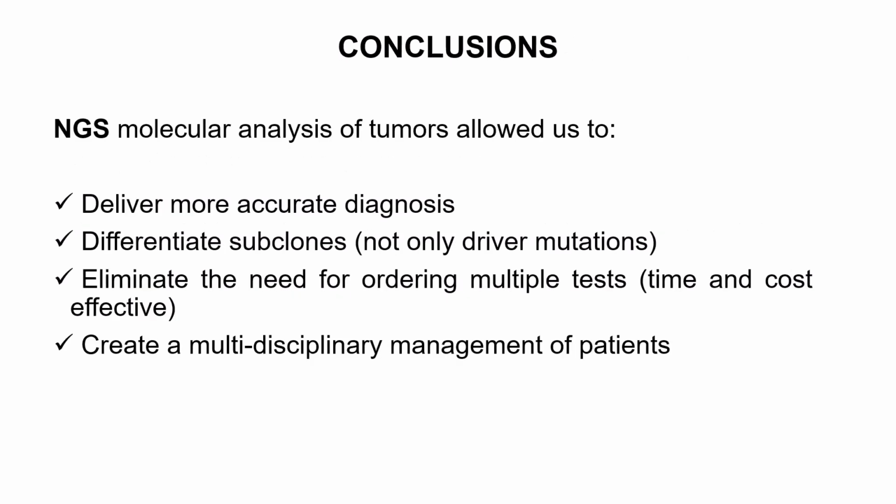In conclusion, NGS molecular analysis of tumor has enabled us to achieve several critical advancements in cancer management. First, deliver more accurate diagnosis by identifying genetic alteration with high precision. NGS helps in providing more accurate and comprehensive diagnostics of tumors, leading to more targeted and effective treatment strategies.